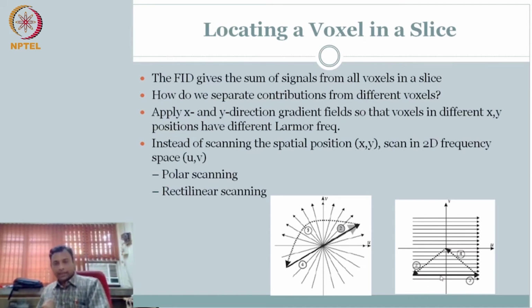To execute the rectilinear strategy, I should not have to start from the origin. I should be able to start from the negative axis and then move left to right. Not only that, I should be able to move along parallel lines in the V direction also. Right now I know only how to start at the origin and acquire data.